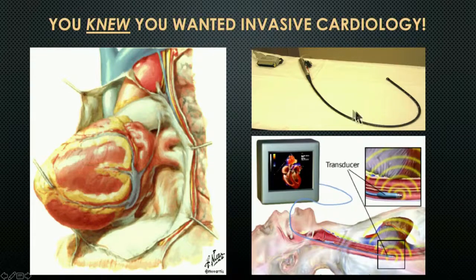By extending this probe, which is a modified gastroscope with an ultrasound array at the tip, down into the esophagus, the close relationship between the esophagus seen here and the left atrium seen here, they are intimately opposed to one another, typically with no fluid or very little fluid, and actually fluid is okay because it actually transduces the ultrasound better. There's no lung tissue between the two of them. We can get very close up and pristine images of the heart.